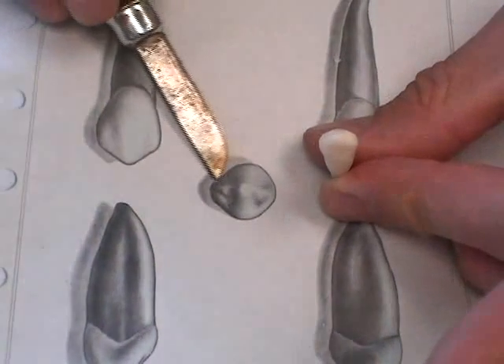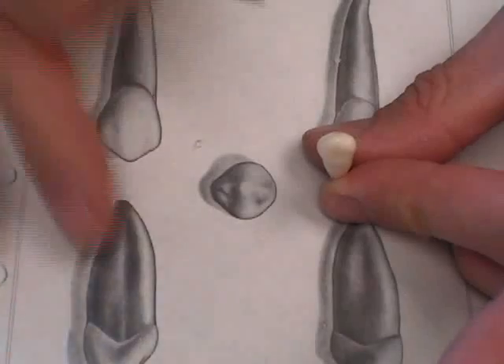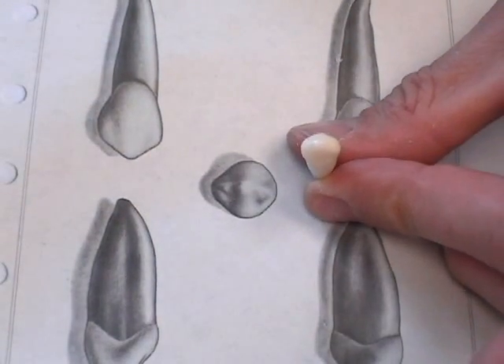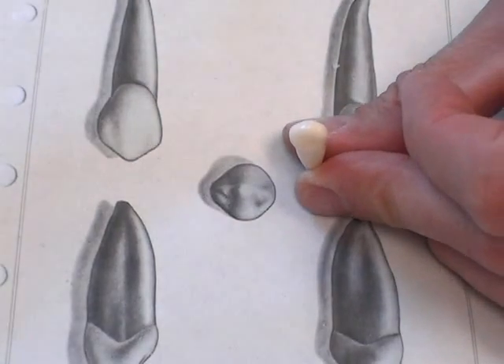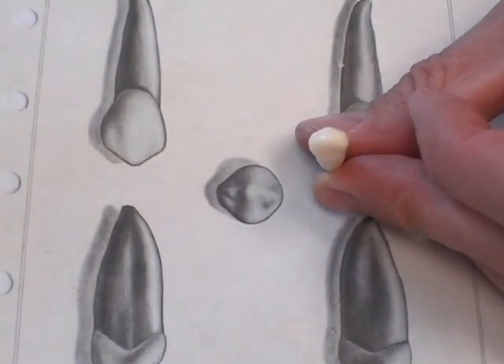The only thing I haven't really done is this little indent right here for an incisal view, but that's going to come as I form my anatomy, which will be the next step. I don't think I'm going to change anything from that view. Your next step is to carve the anatomy.